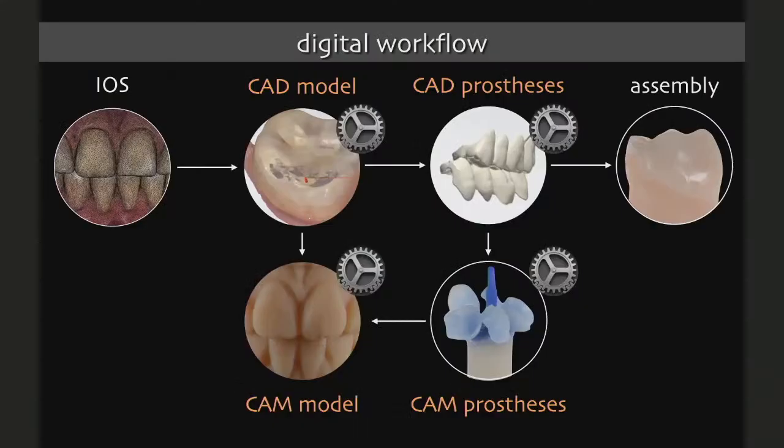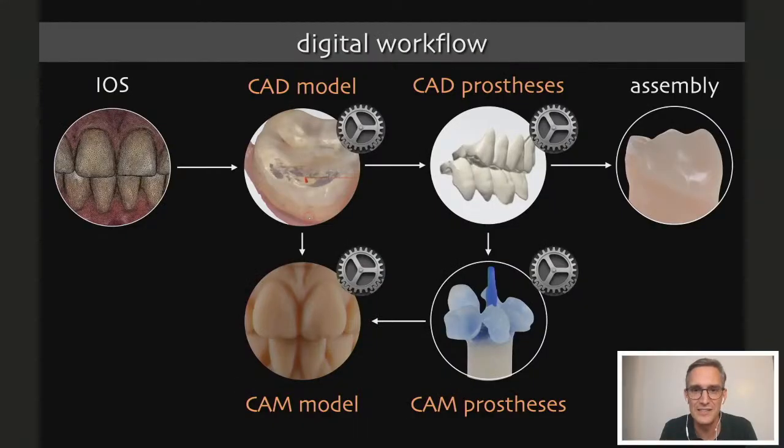And what is important to understand is that we have a lot of parameters. So even in the computer-aided design software, there are some pre-settings, and based on the clinical situation, he needs to change these settings, but that's based on his experience. Maybe it's based on the clinical situation or the indication.